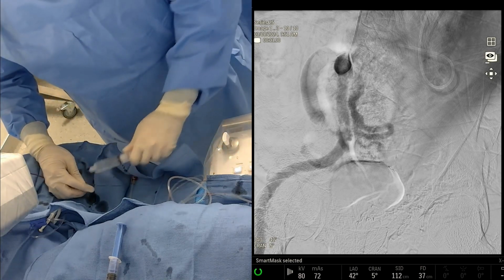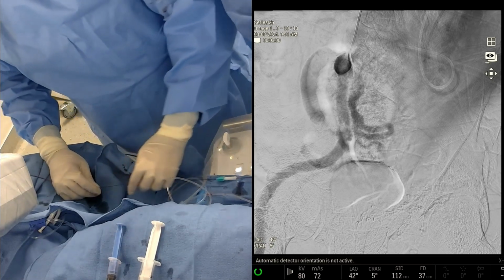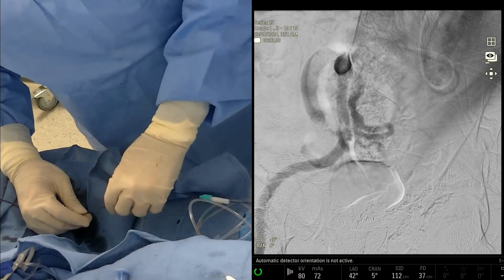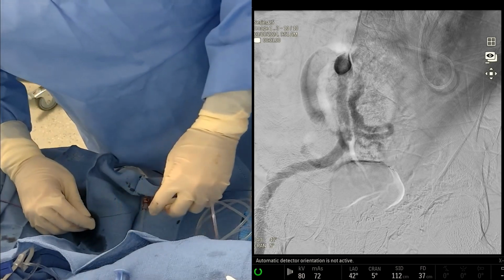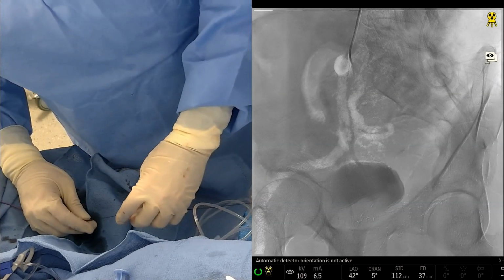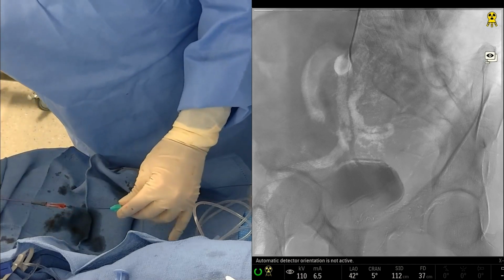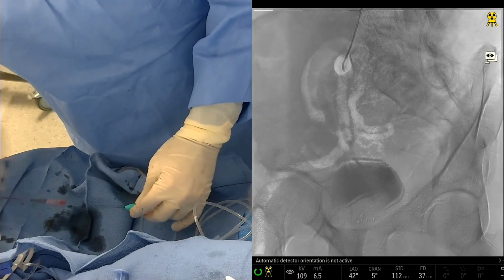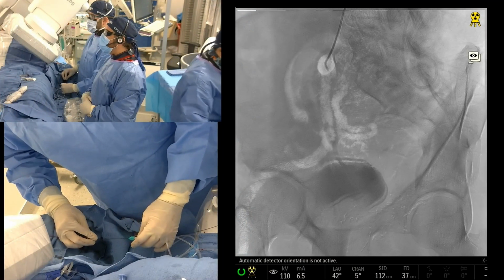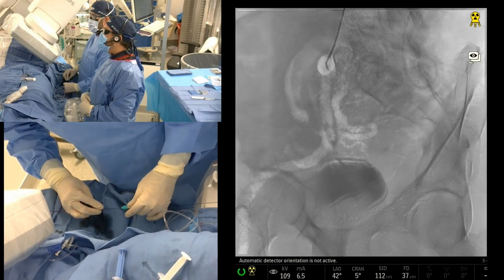Well, even just looking at that glue cast, looking at that embolization, that's quite a vessel to recanalize that entire way. We're not dropping a small glue plug. We're not just going distally with a few millimeters. There are so many studies that have looked at the effect of glue on the artery, and it really creates a fair amount of vascular endothelial damage and inflammation, and so we want to use that to our advantage. And that's one of the best properties about glue, in my view. You want something that can do that.